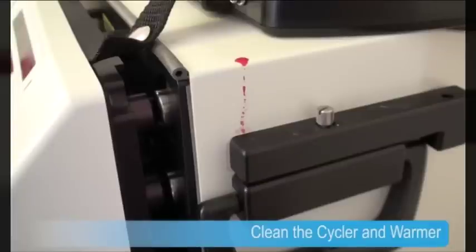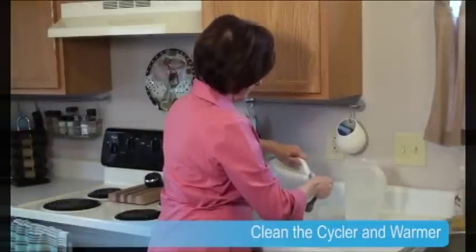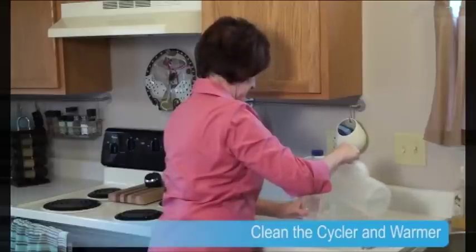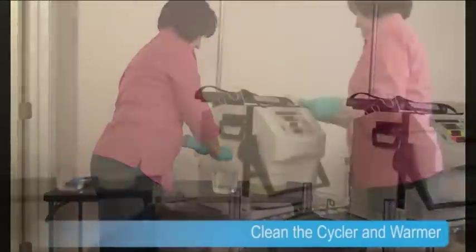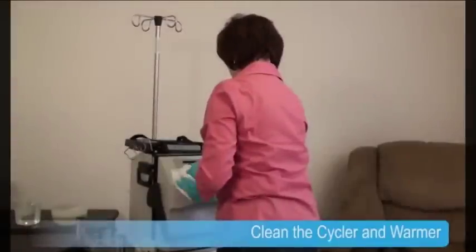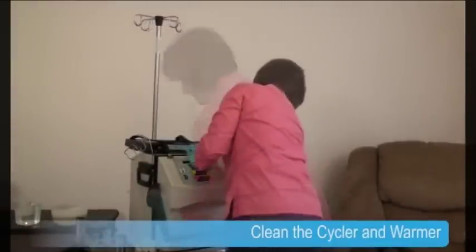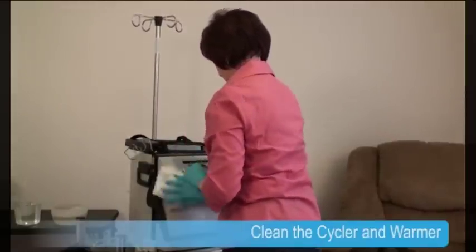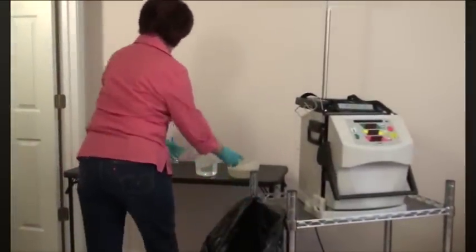It looks like there's a little blood on the cycler. Lois makes a bleach solution to clean blood from the equipment. The solution is a mixture of one part bleach to 100 parts water. To make the solution, she uses one tablespoon of bleach with one quart of water. She wipes down the cycler with the bleach solution, letting it sit on the cycler for 10 minutes. After 10 minutes, Lois again wipes down the cycler with the bleach solution and lets it sit for another 10 minutes. Then, using a clean paper towel and tap water, she rinses off the bleach solution and allows the cycler to air dry. When she's done, Lois throws away her bleach solution and other cleaning supplies.